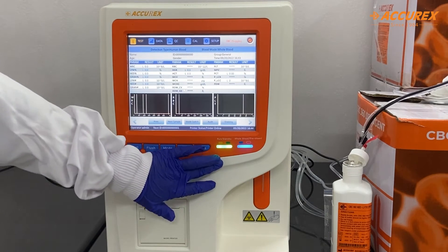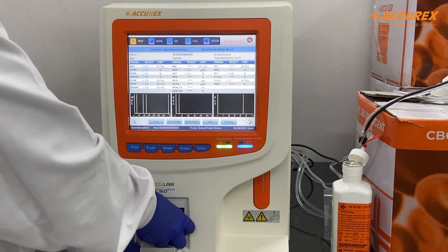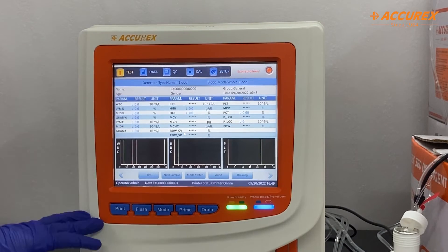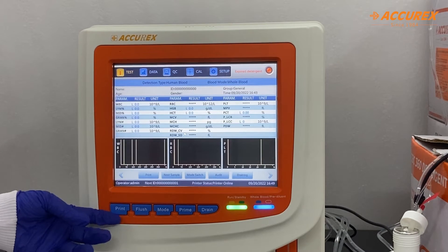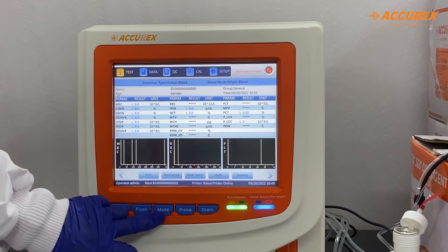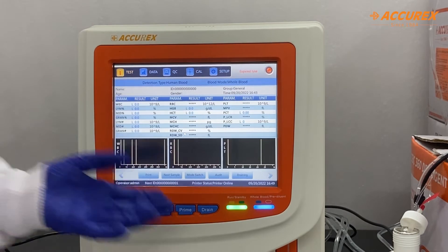Now the light has turned green. I will insert the printer paper roll — you just pull this, insert it, and push it back. Here there are five different buttons for different uses. The first one is for print — after the results you can click here and it will automatically print. This is flush — the chambers will be flushed if you click this button. With this button you can select the mode. This is the priming button where reagents will be filled inside. And the drain button will drain the sample cups.